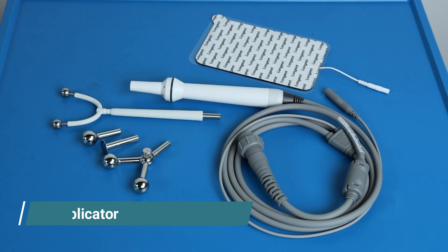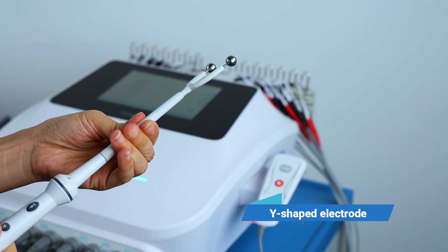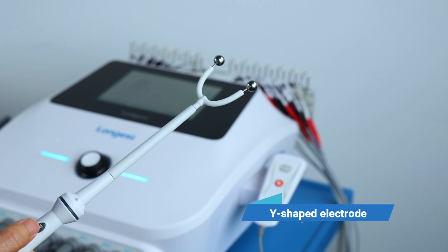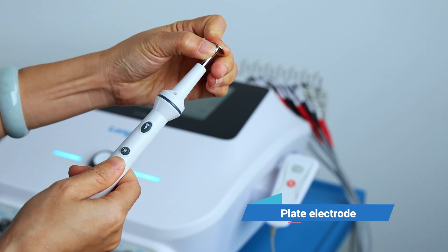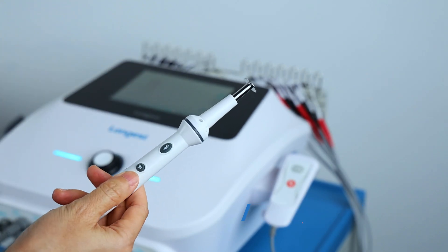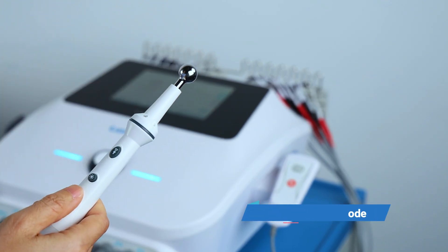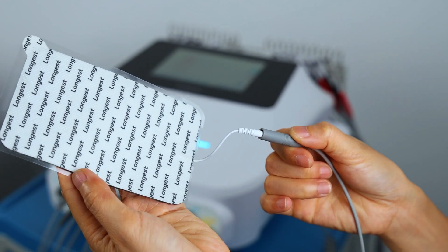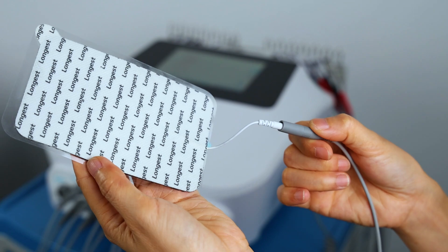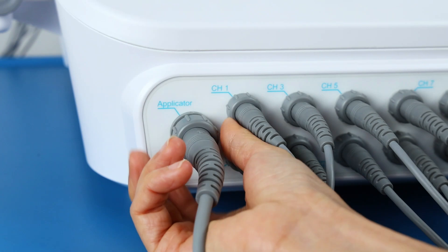There are multiple types of applicator head for different treatment purposes. Connect the other end of the applicator wire to the device. Follow the arrow mark and insert into the socket, then tighten the screw.